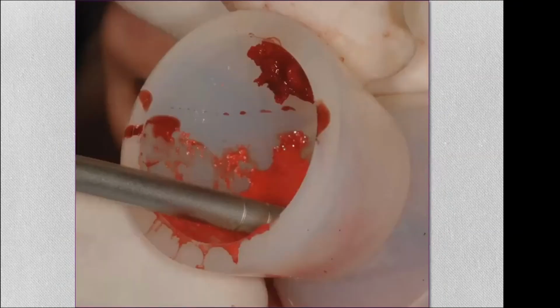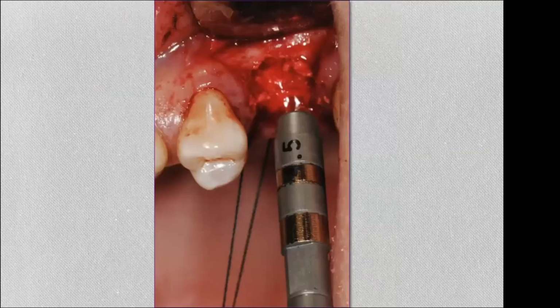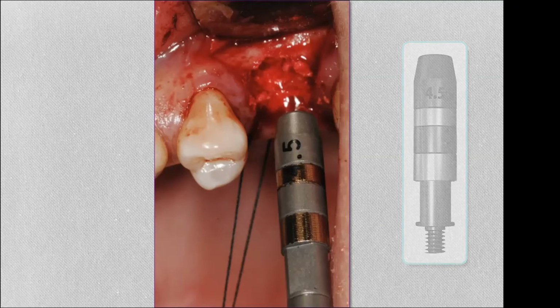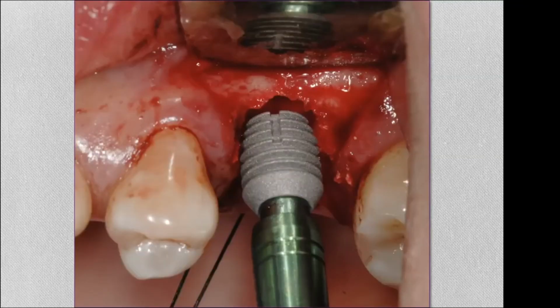We introduce it into the osteotomy with a syringe, metal syringe carrier, okay? Again, you don't blast it like a shotgun blast in there. You want to inject it very slowly. That's starting to work on lifting the mucosa off of the floor. We use the next size down side expander. This is the 4.5 or a 5 millimeter osteotomy. It's round, smooth shape, helps sort of deflect and push the particles in all directions. Again, when we tap, they behave like a non-Newtonian fluid, lifting the mucosa, separating it, and also compacting against the bone, etc.